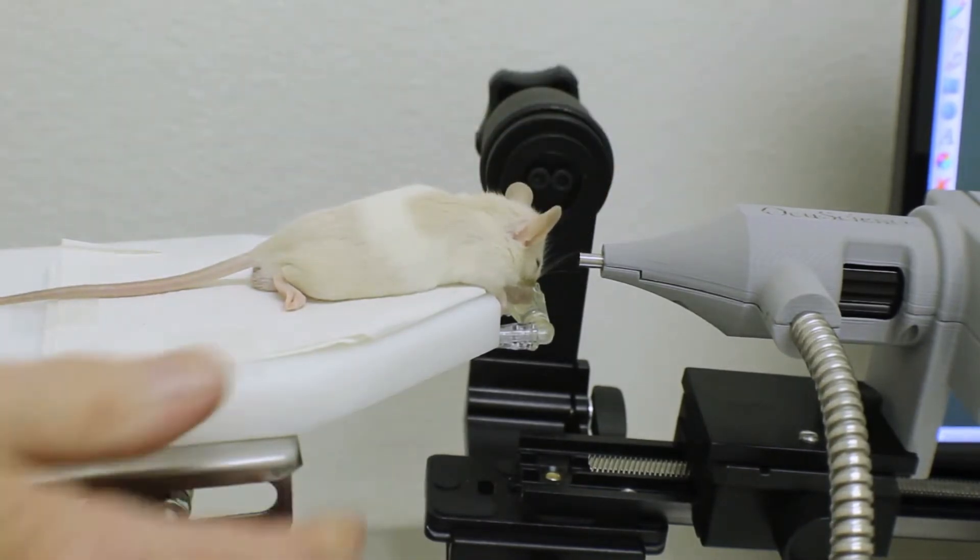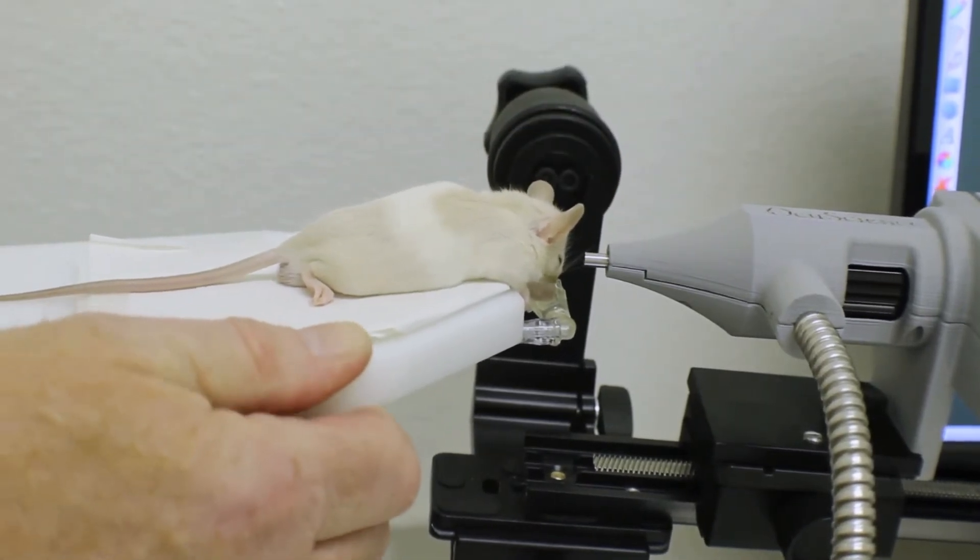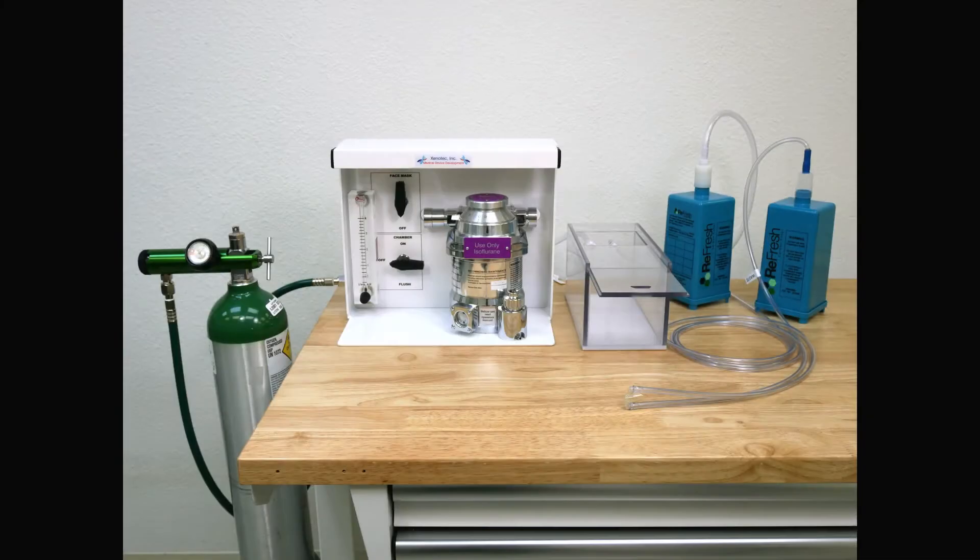The exam table is height adjustable with a top plate that is magnetically attached for fine adjustments, and it also features an embedded rodent face mask for use with our compact small animal isoflurane anesthesia system.